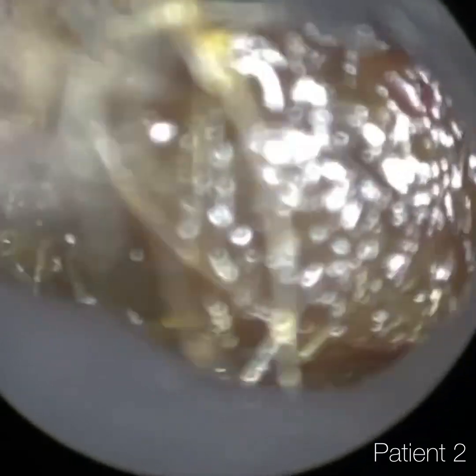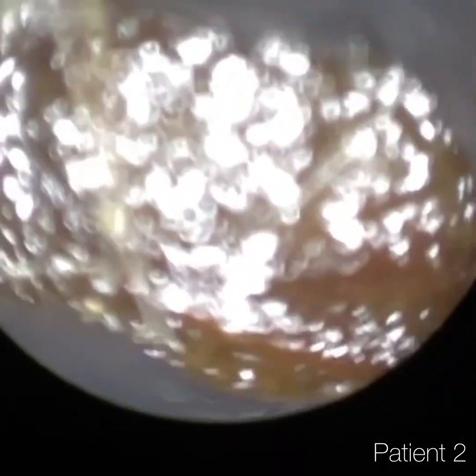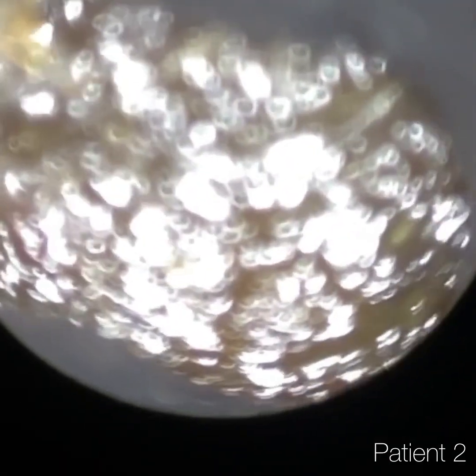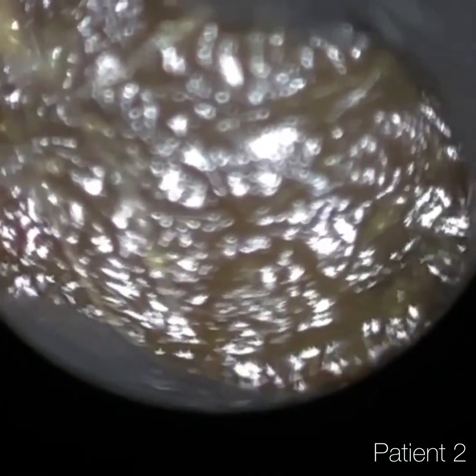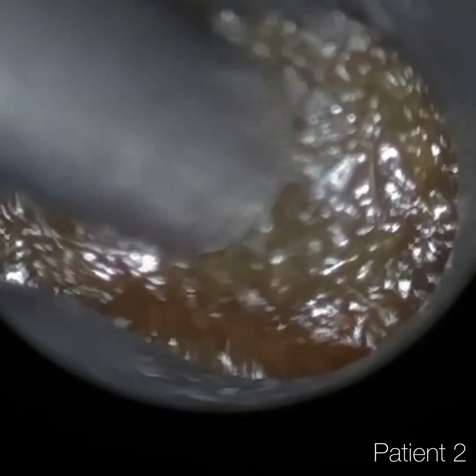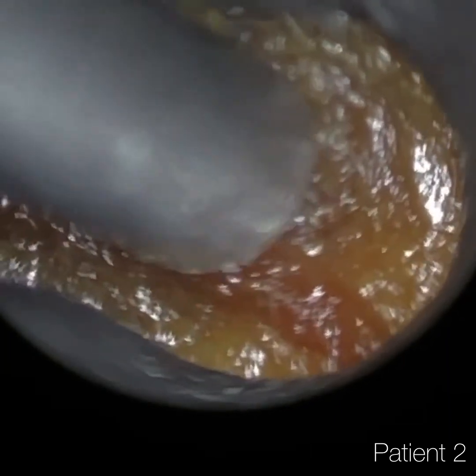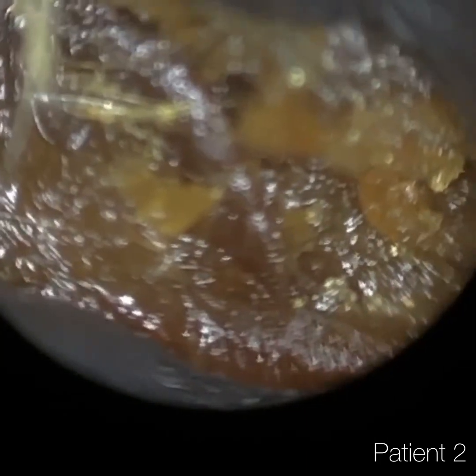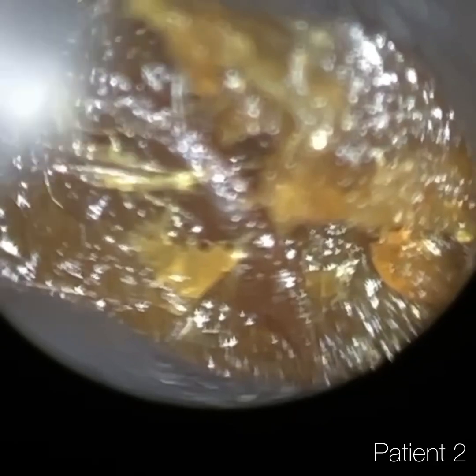So this is patient two, starting off with the left ear. Just stretching the ear wide open. I'm using the 4.25 mm speculum again. I just reduced the exposure slightly to begin with, because the wax is near the entrance — it was getting a slight reflection — but in a moment I do increase the exposure again. And all this can be done live whilst the Waxscope is in situ.